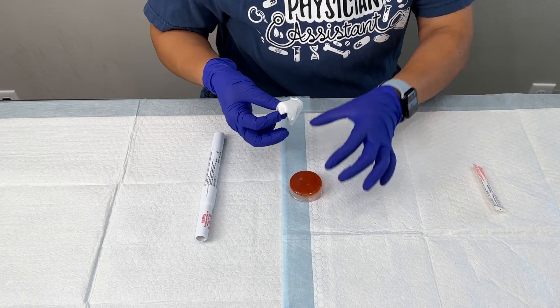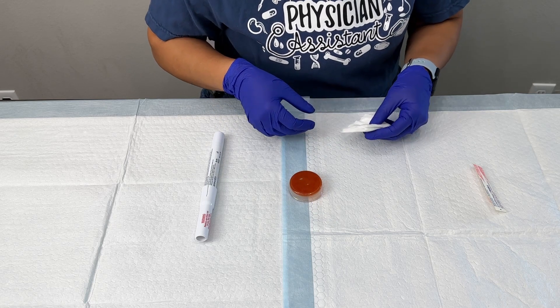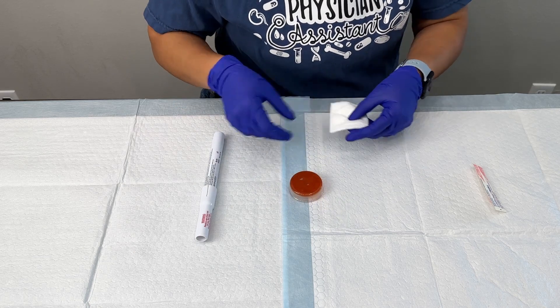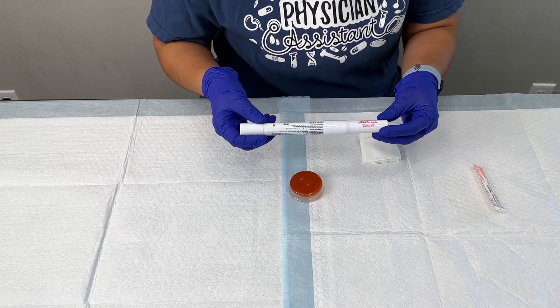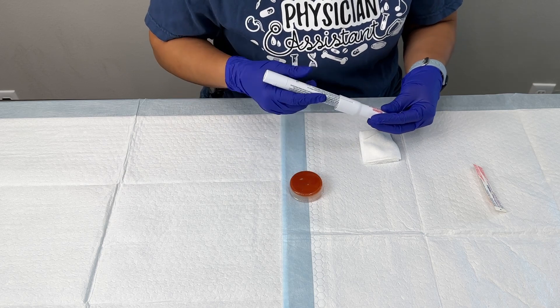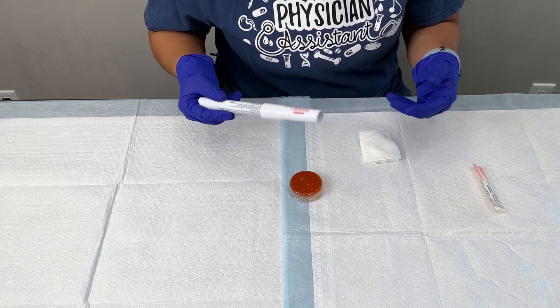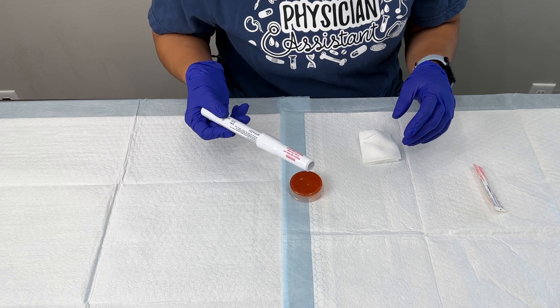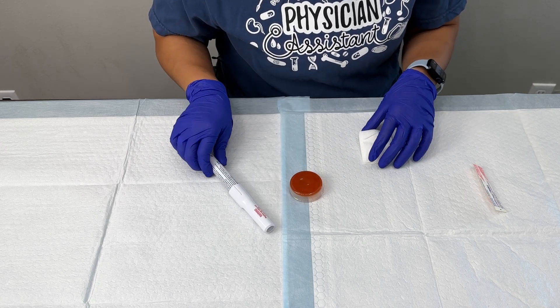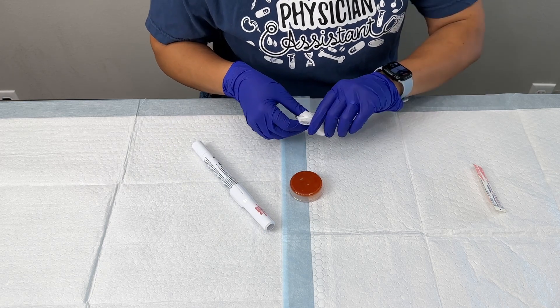After I'm done cleaning the top of the nail, I want to use some normal saline to wash off any of that cleaning solution, because we're going to be using a hot cautery pen and we don't want to cause a combustion on the nail. We don't want to use alcohol or anything flammable because when this heat pen touches it, we could cause a fire or a flame, and that wouldn't be good for our patients.